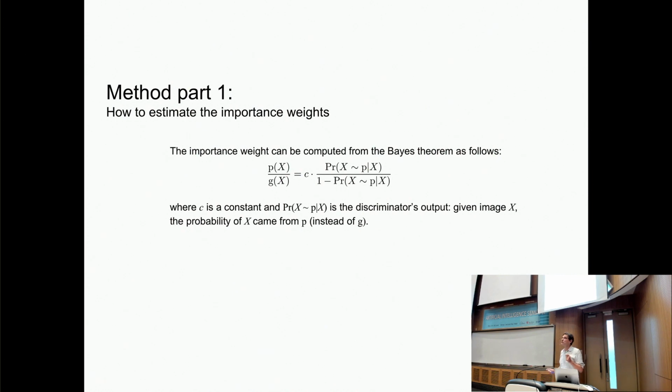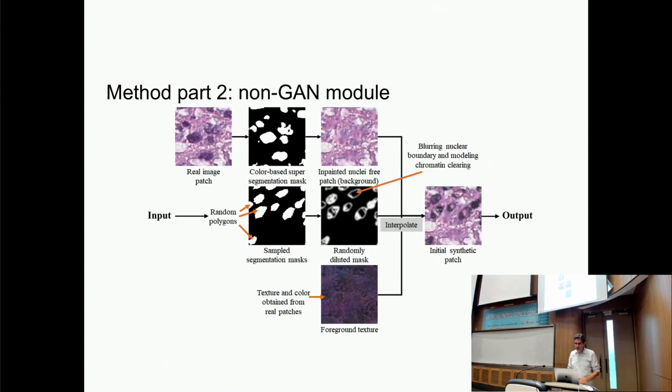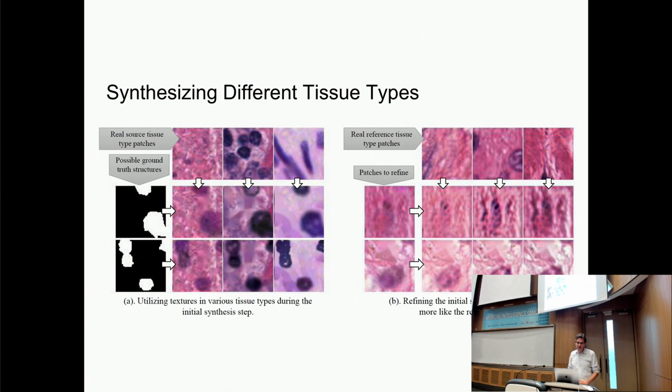And then we were training classifiers. We were feeding all this data to something that was trying to do the segmentation. So what we learned to do is we actually learned to estimate for each patch that we generated how good it is. And the good ones, the ones that really look more like real patches, we just gave them higher importance. Everybody got a little bit, but we gave these guys higher importance. So this was the big thing. I'm skipping this. This is how good our results were.